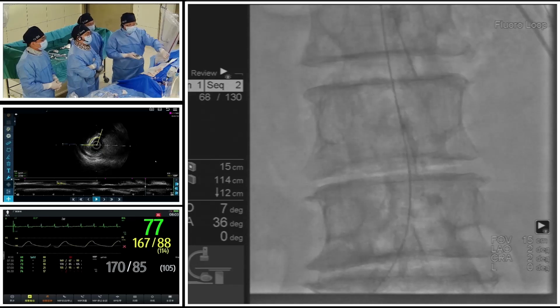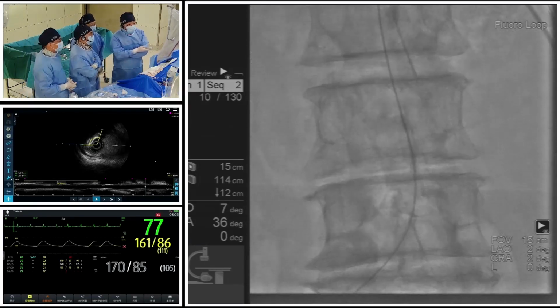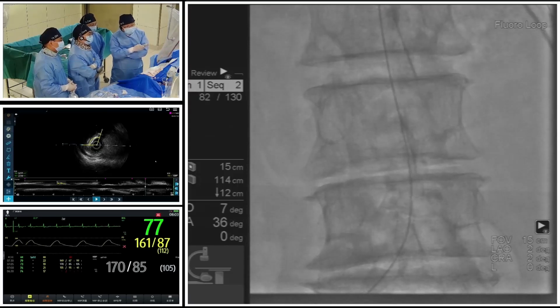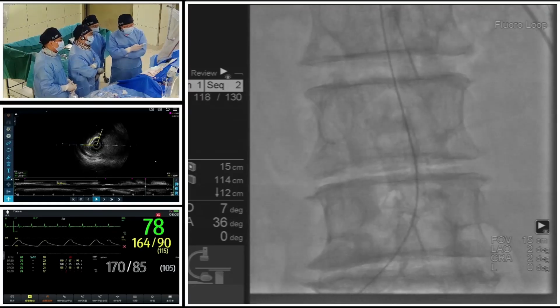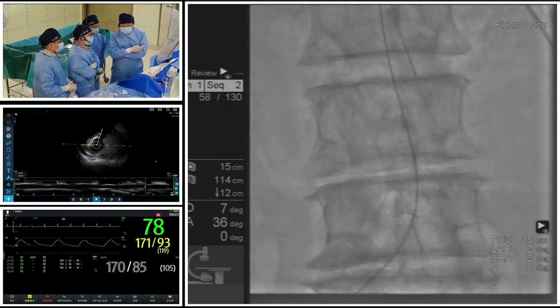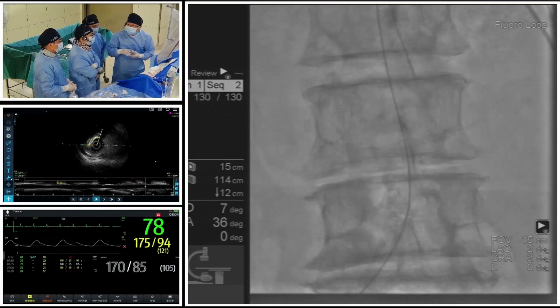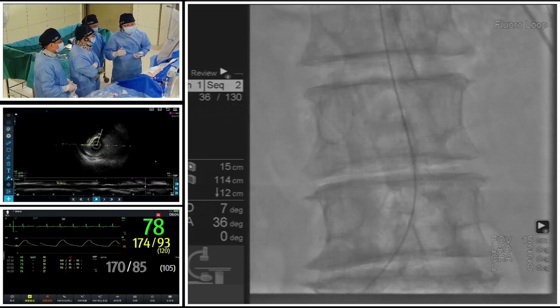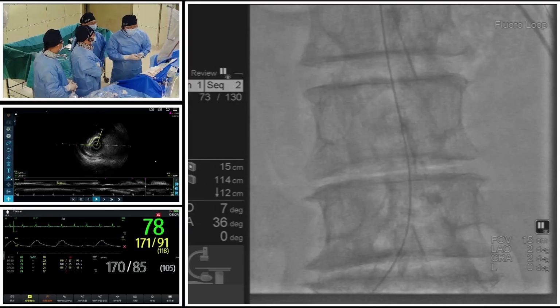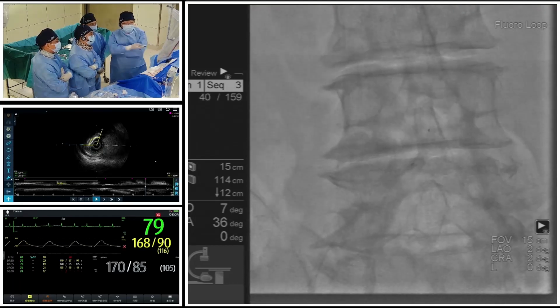And here is still a small tip and trick that I showed to the audience last time, because we can see the abdominal aorta also has severe calcification, and the guiding was a little bit difficult to advance further, and there should be a calcified plaque. If we force it to advance, even if we rotate, the guiding still couldn't cross. And this time we use the balloon-assisted tracking technique.